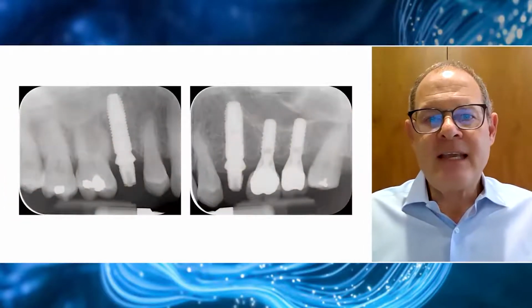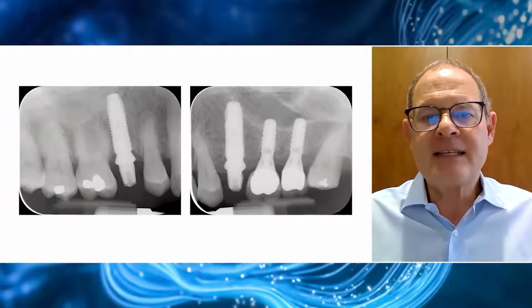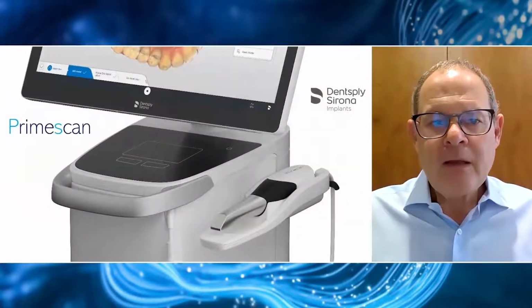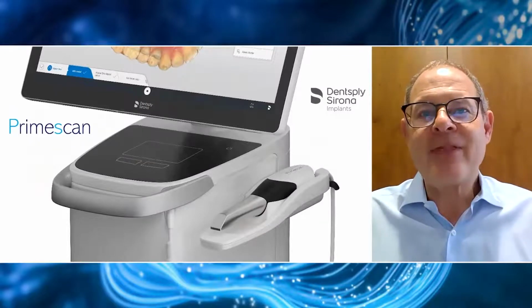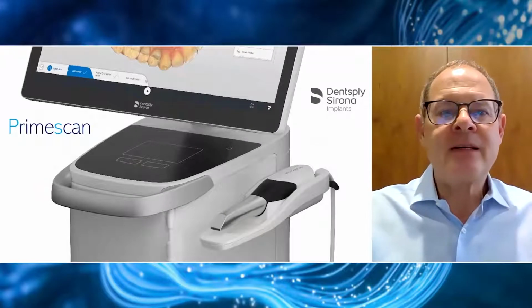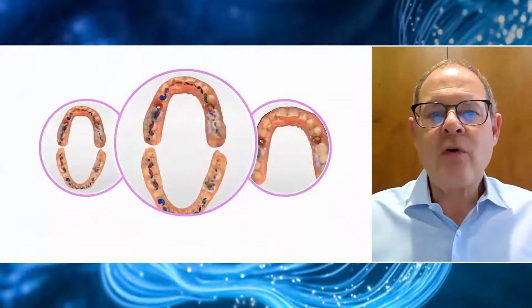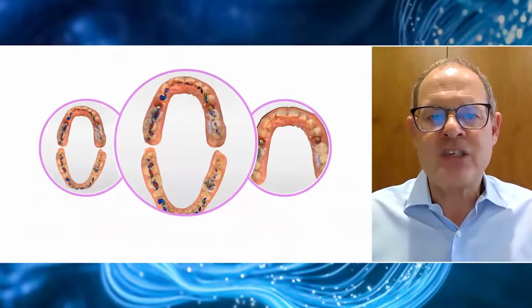And here you can see the 2 implants placed very precisely to the floor of the sinuses with these temporary direct abutments in place. Some 3 months later, now in lockdown number 3, but thankfully we were allowed to stay open. She came back and we went through a Primescan, as we discussed before. And here are her 2 beautiful Primescan images.